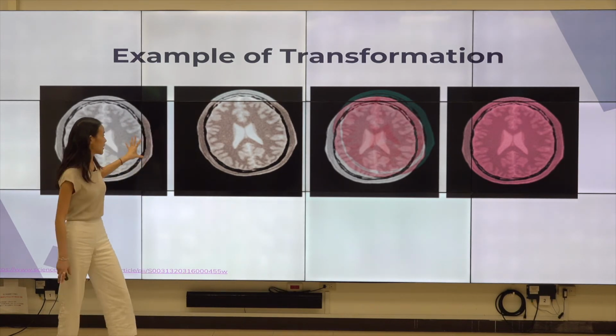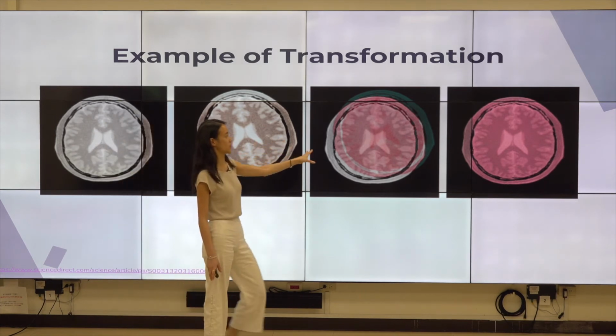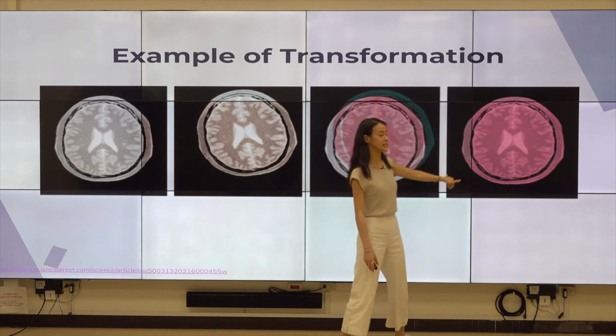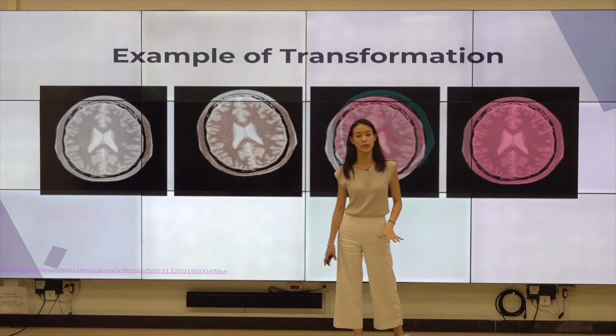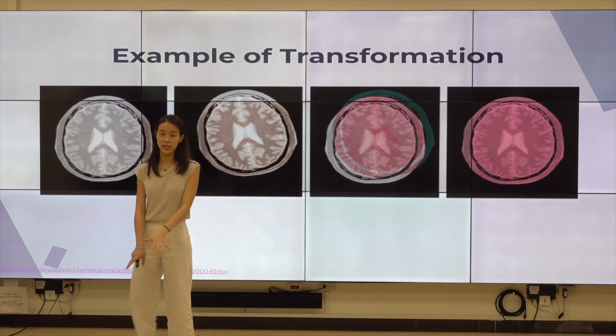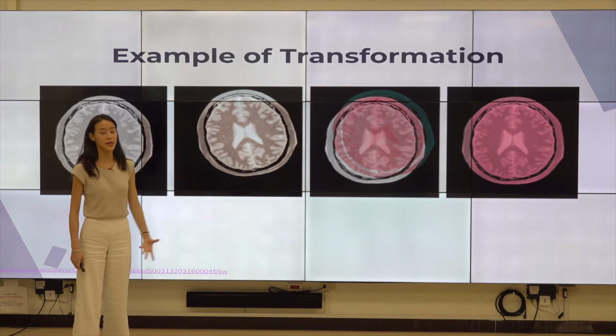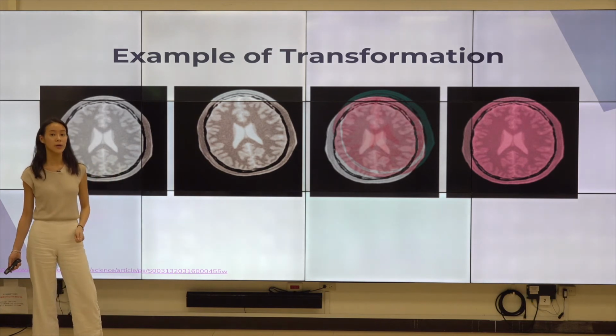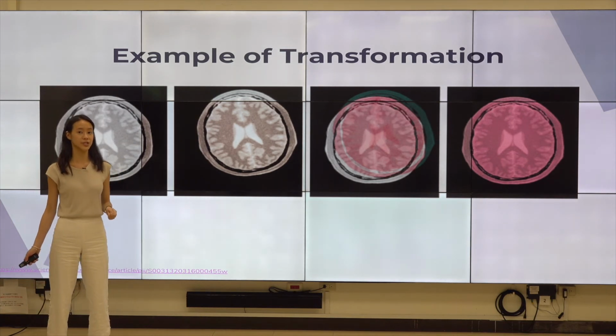And so it goes through each of these iterations, moving from side to side until it finally has these two images overlapping each other. And that's when you know registration has happened. Same thing as your hand situation. And I'd recommend you do it yourself a little bit to understand what I'm talking about when we're talking about the intuition behind registration.